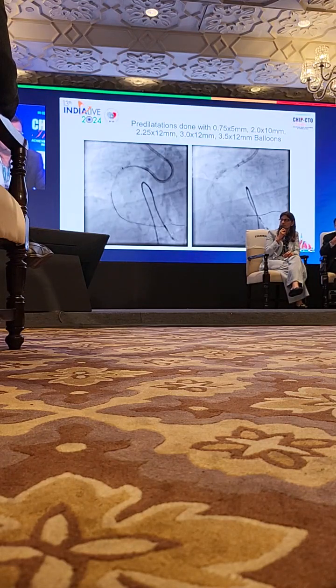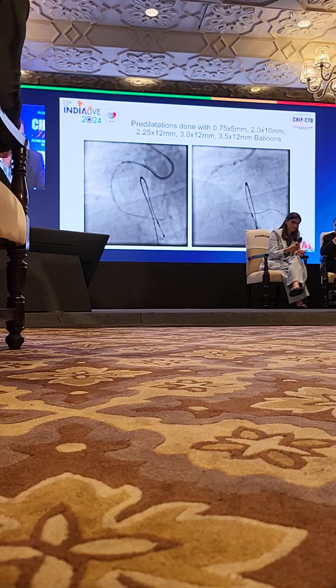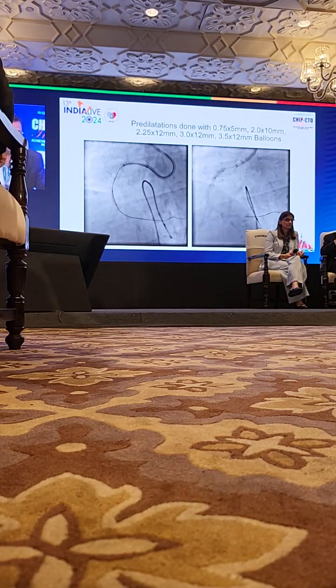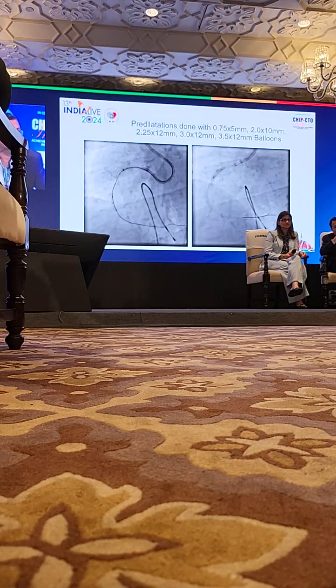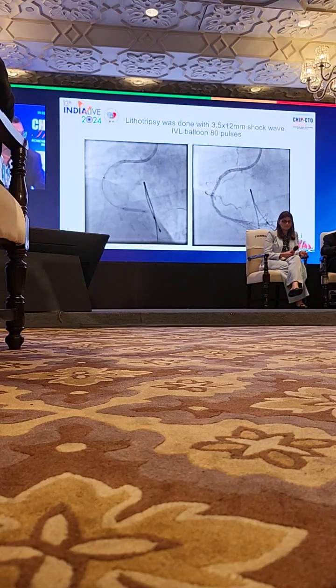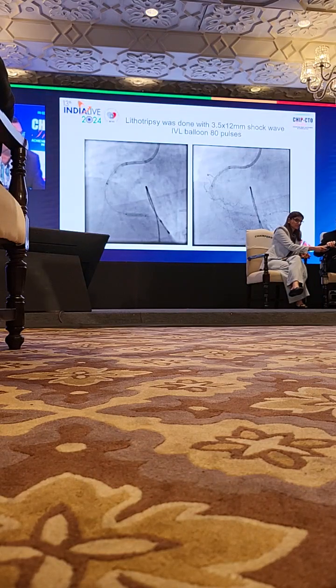Sinus. That is the cause. First the guideliner you have taken out, after that the guide was removed. Spontaneous recovery of the blood pressure. Maybe there was no flow, so at that point of time we gave vasodilator.